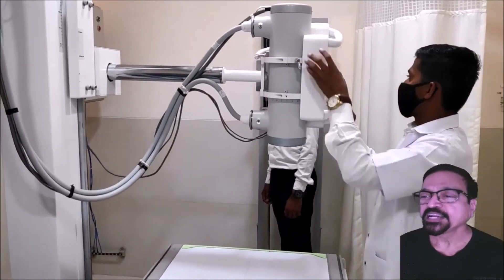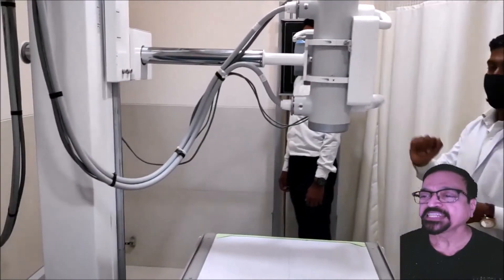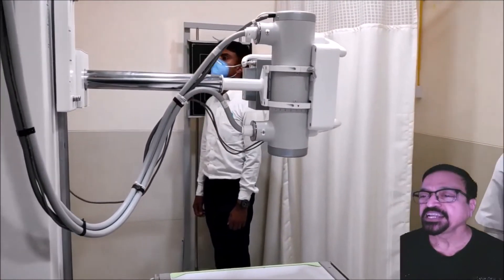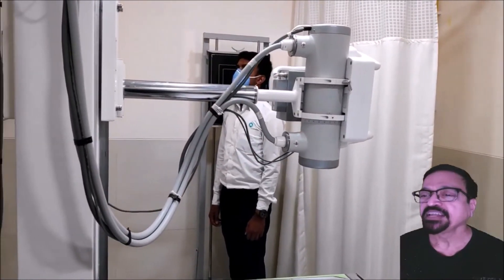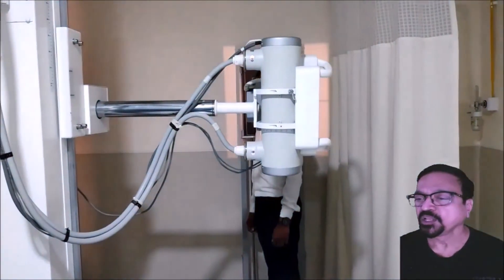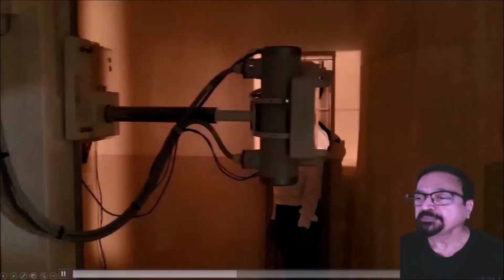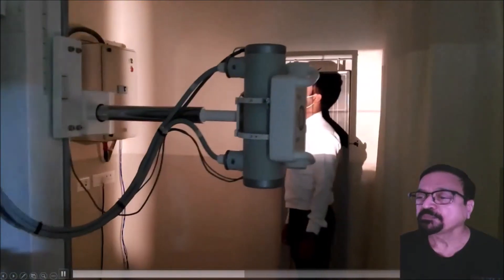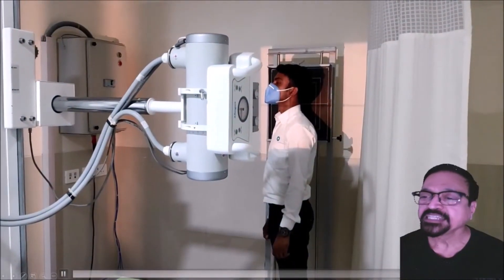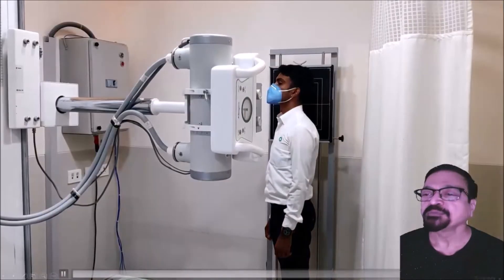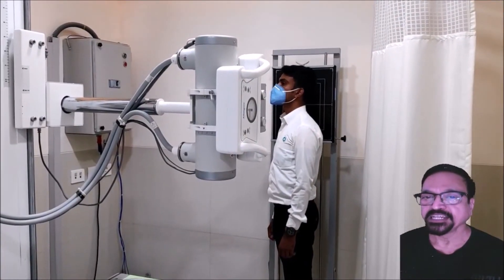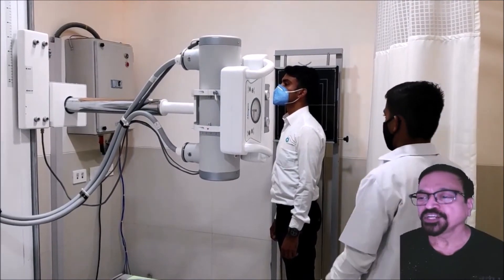Earlier you must have seen it was with 45 degrees angulation. Here we are seeing it with very minimal angulation. Angulation depends on what part you want to radiograph — sometimes it is the intervertebral foramina, sometimes it is the zygapophyseal joints.